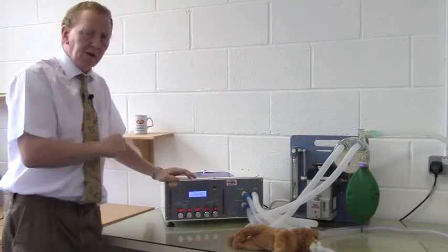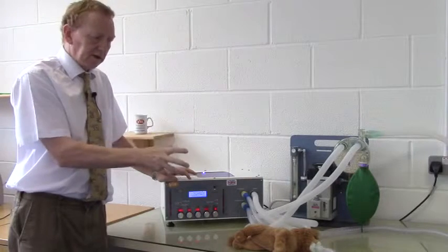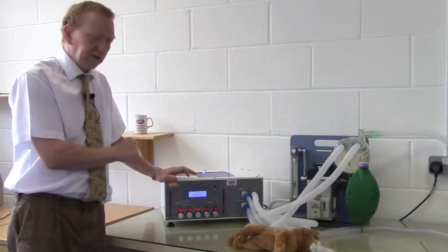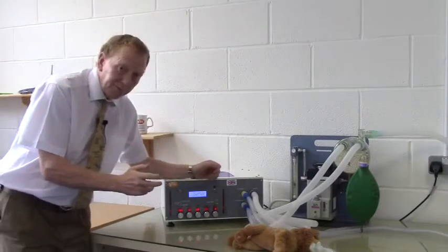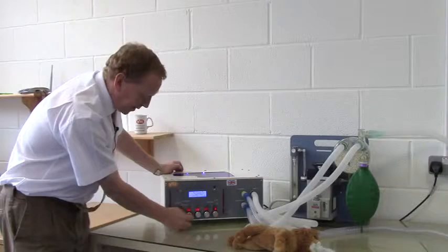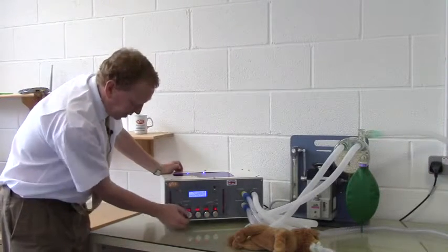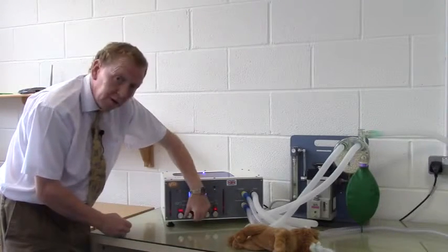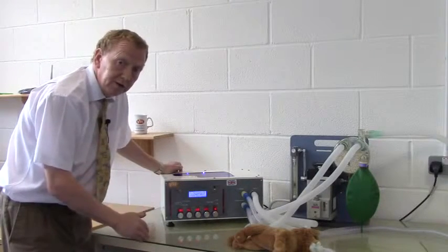So in the previous demonstration of volume cycling, we gave 150 mils to Leo and he got a maximum inspiratory pressure, or peak inspiratory pressure at the end of inspiration, of 12 centimeters of water pressure. To set up for pressure cycling mode, we're going to turn the inspiratory knob completely around, as far clockwise as it will go, until it says PL, indicating pressure cycling mode. You notice when we do that the volume knob goes from a volume to a flow, because in pressure cycling mode we're going to deliver a fixed flow until we reach a set pressure.